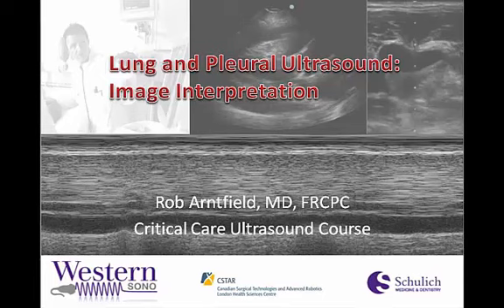Going to talk to you today about lung and pleural ultrasound. We've previously spoken to you about lung acquisition techniques and our protocol or sequence we use here at Western. If you haven't seen that, I would suggest watching that first.